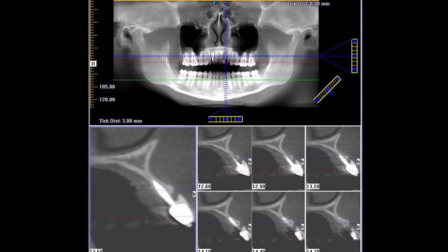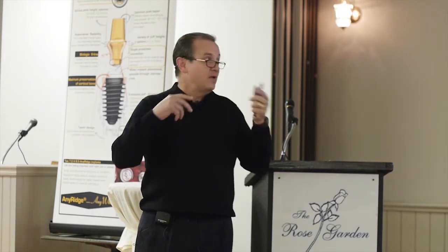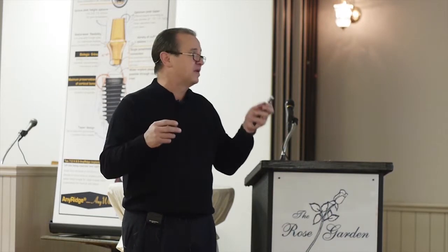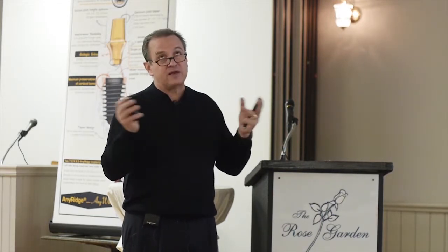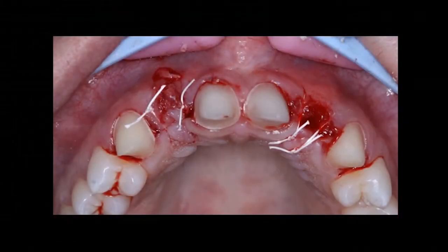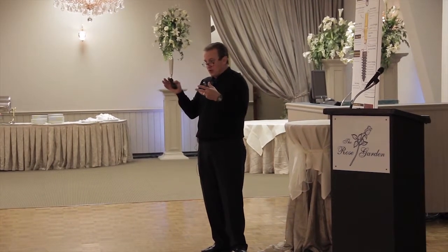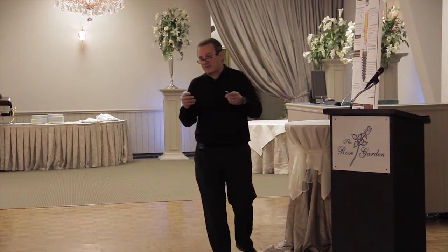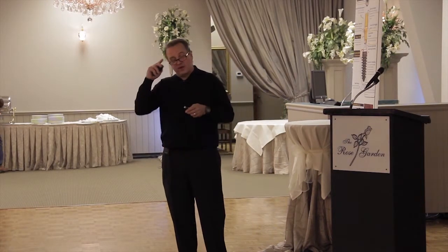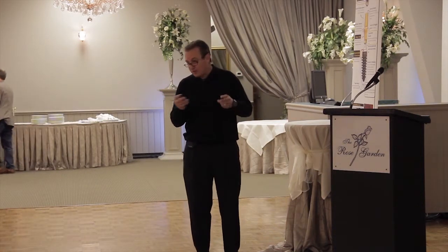But I talked to the mom, I said, we can do all this bone augmentation and build the ridge up and this and that. And I said, on the other hand, we can do some conservative preps, which I don't like to do, but she was so burnt out and so upset and frustrated that we did the more aggressive thing, which used to be what we call conventional dentistry, and just restored it with 2-3 unit bridges. Now that I've had more experience with the sonic weld system, which we'll talk about in a little while, I might have gone back and grafted those and waited, but I can tell you they were waving the red flag. She really wanted to get into something soon, and so we opted for what we used to all consider to be standard of care.